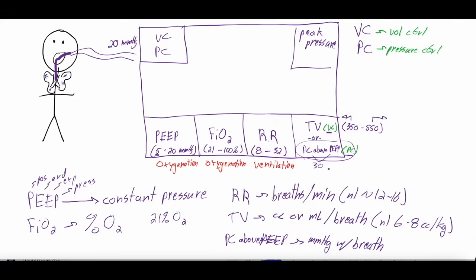But these are the four basic or 5 basic settings for all ventilators. We should say, apologies, that the tidal volume also helps with ventilation, right?